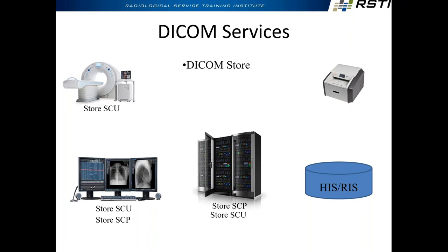So DICOM store, if I want to send an image from here to here, what role is this workstation playing? Server, the provider, right? If I want to send an image from here to here, what role is this playing? Why would the PACS ever need to be an SCU?